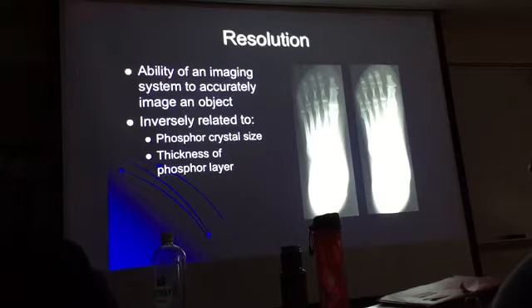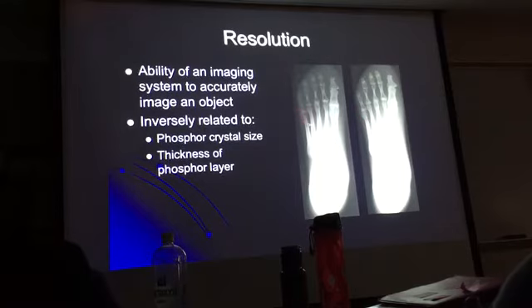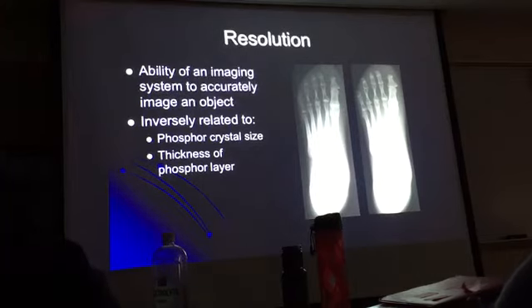Okay. But now, let me point something out to you. Look at here. That's where I was looking. Okay? Look at here. Compare the two. Here, here, here. We're looking at the bony trabeculation. Remember, resolution is measured. How is it measured? Numerically. You know that.